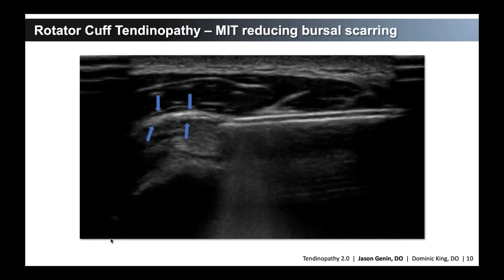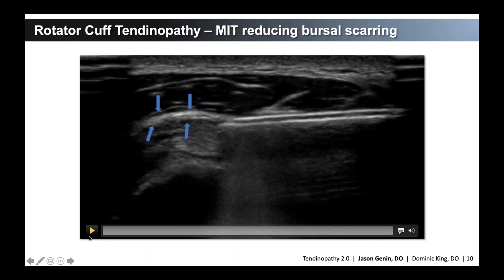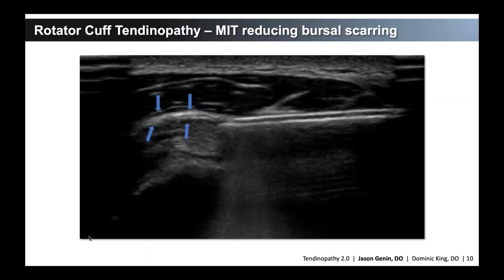Once through the deltoid and comfortable, many people find it initially difficult to guide the probe into the desired tissue. One thing we've utilized is the addition of an 18-gauge guiding needle. Depending on patient size, we can use a traditional one-and-a-half-inch needle or a spinal needle. We place the 18-gauge under ultrasound visualization to reach our target — for example, the bursa highlighted over a piece of calcium — then add the TenJet probe just under the 18-gauge. This creates a visible guide track, then we remove the 18-gauge and we're in our desired treatment area.